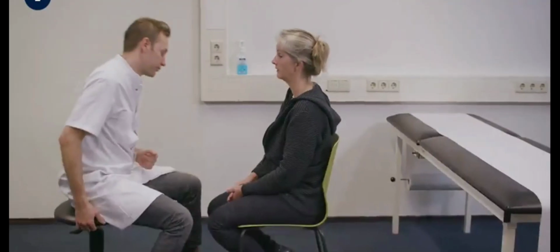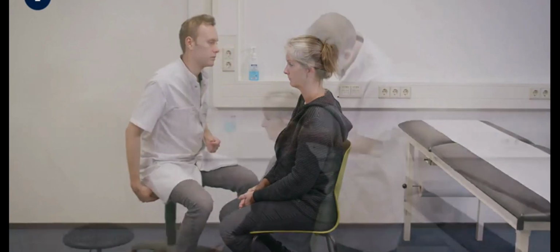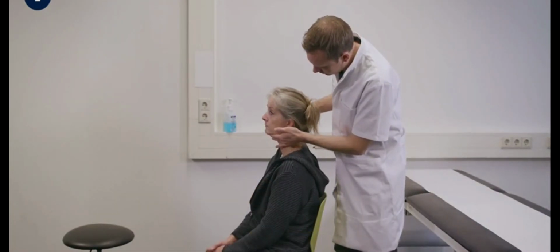To perform an examination of the ear, the patient is positioned on a chair in such a manner that the examiner has access to both ears and can easily stand behind the patient during the exam. Exposure is from the neck up, removing any hats, scarves, or high-collared sweaters.